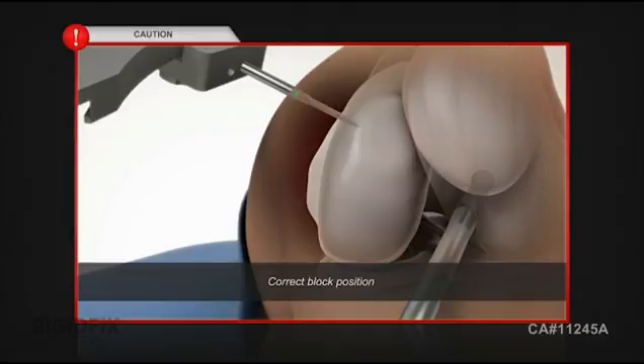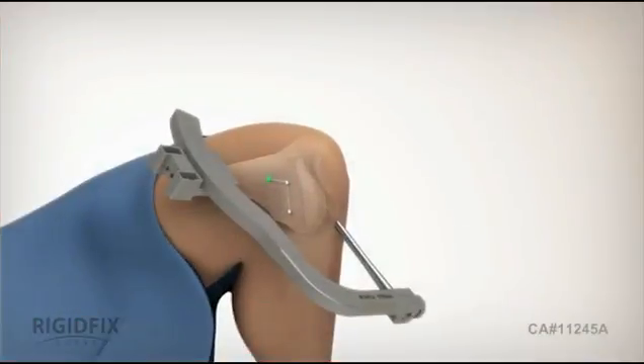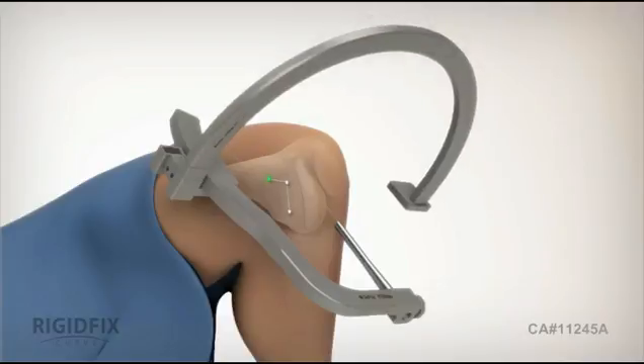CAUTION: Make sure the block is positioned correctly anterior to the medial epicondyle to avoid the trocar diverging into the posterior of the knee. Next, attach the arc securely to the frame. The arc is used to determine the available lateral bone stock.